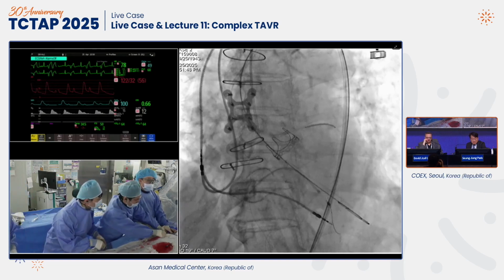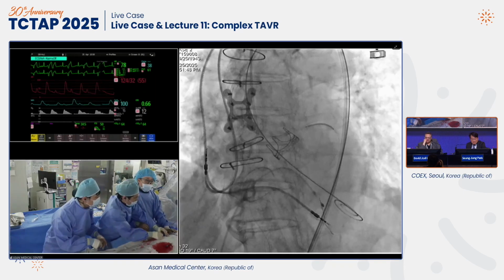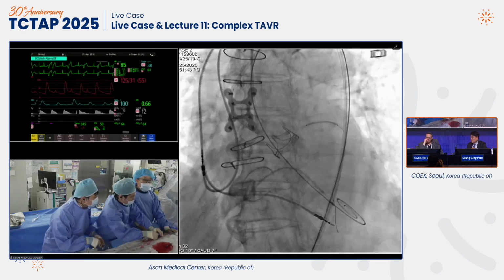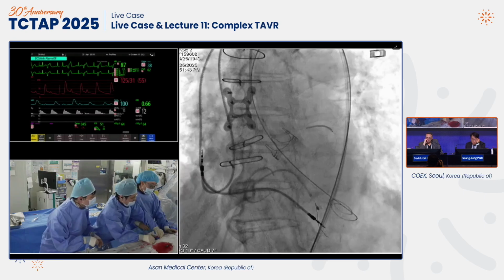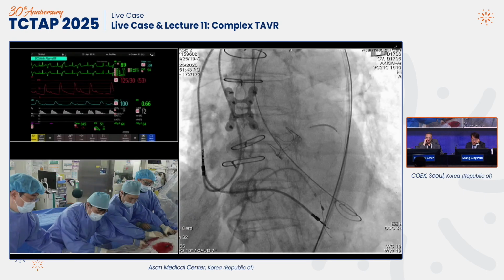Was it the right coronary? I mean, left coronaries don't usually take that long. Left coronary. Huh, okay. Right coronaries can be hard. Dr. Dabir is a pioneer of the basilica, but even his live case took 1.5 hours to do.